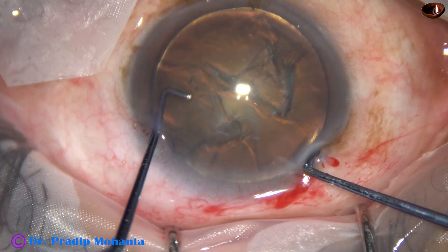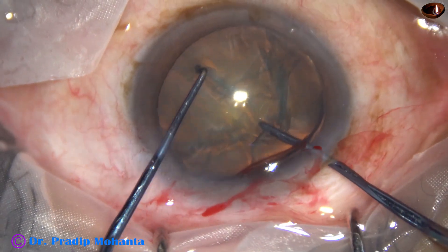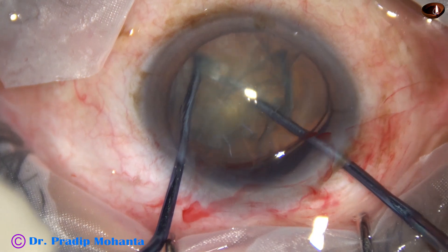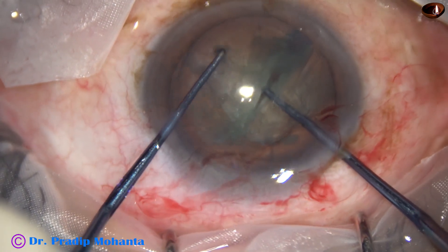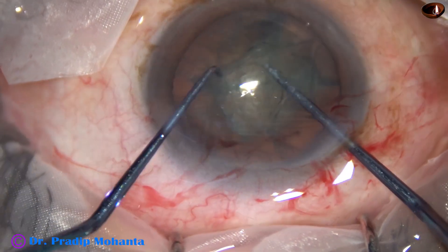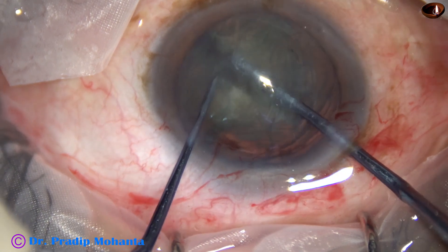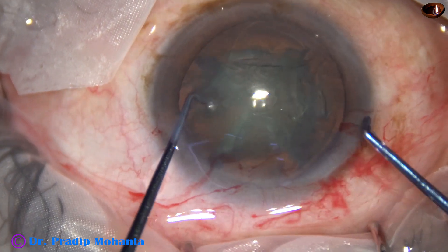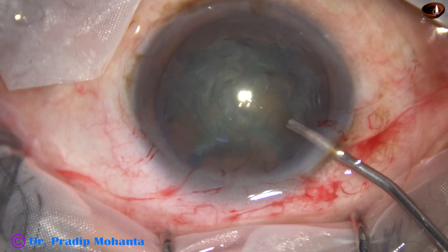And now see the pre-chop. The pre-chopper is in the right hand, the sustainer is in the left. The nucleus sustainer hooks the opposite equator. Between the two instruments, the nuclear mass is cut into pieces. And in less than one minute, we have got four pieces out of this nucleus.